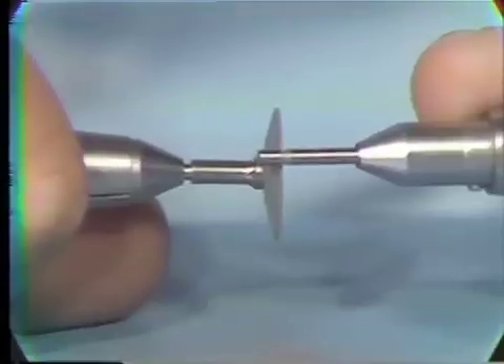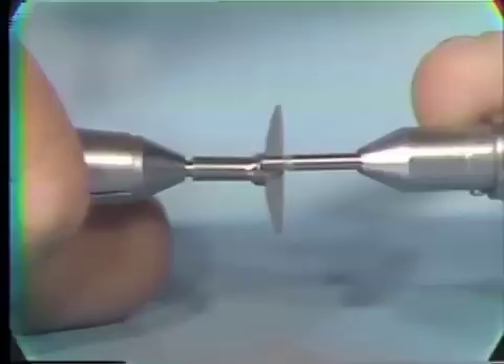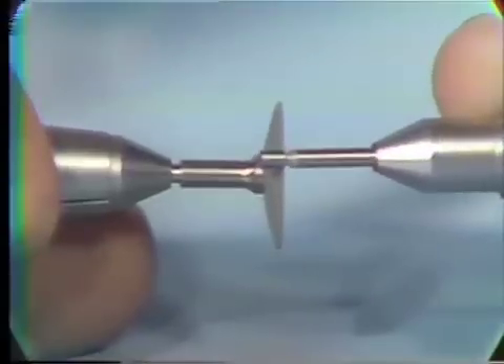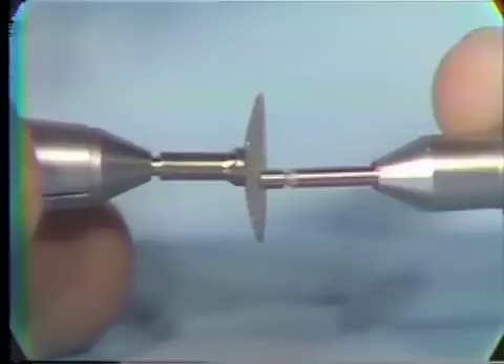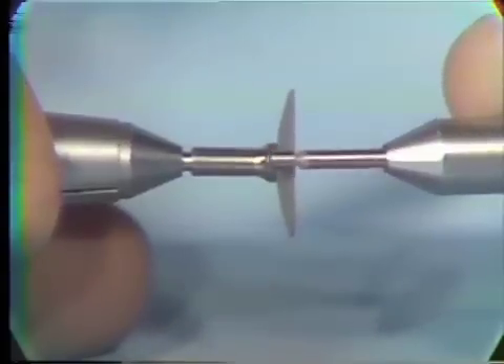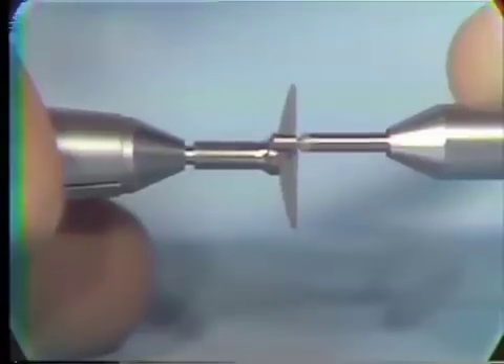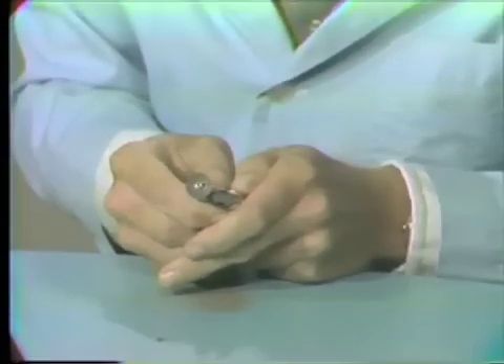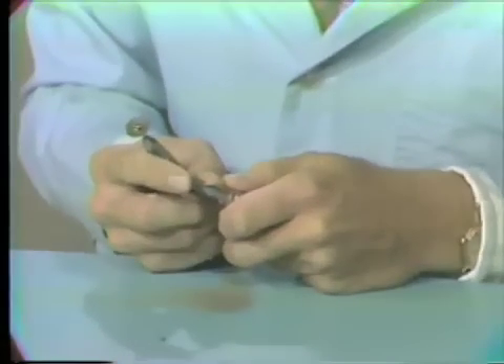As you notice, I am cutting with a carborundum disc. You could also cut with a green stone or the number 56 burr if you are using the high speed. Once you have cut off the end, the next step is to smooth the very end of the burr.